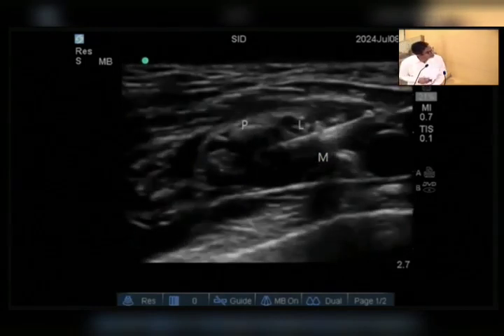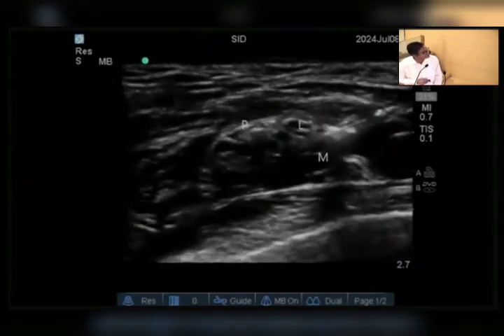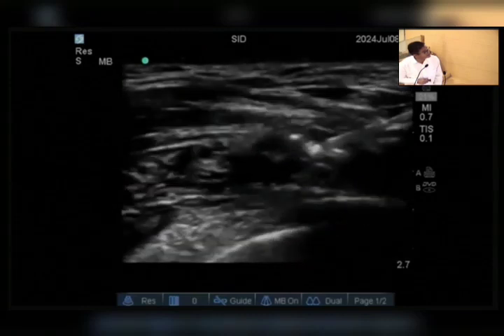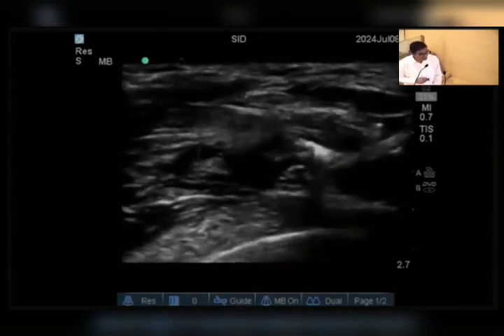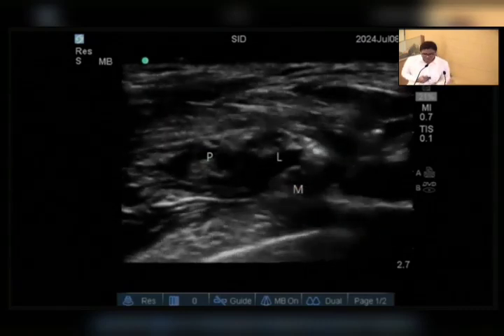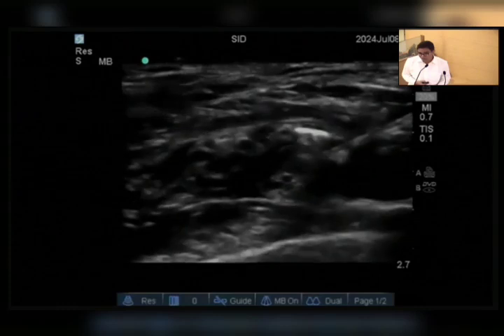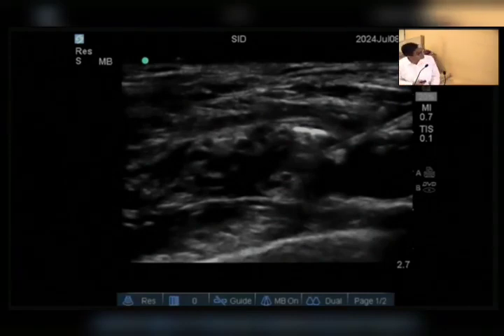See, here when I am injecting, I found that these two cords are connected with each other, and there is one septum over here, and this medial cord is separated from these two cords. So again I am redirecting and targeting this medial cord. This is pleura and this is the serratus anterior muscle. So here the drug volume that I use is 20 ml of local anesthetic. You can go up to 30 ml, but 20 ml is good enough volume, and the researchers say that it gives rapid onset. Even I personally feel that this is rapid, it gives rapid sensory and motor block, specifically in the brachial plexus.